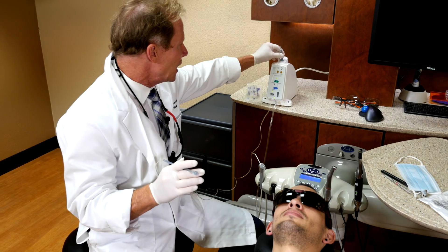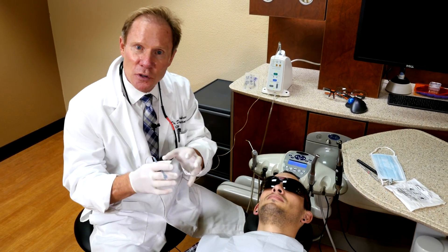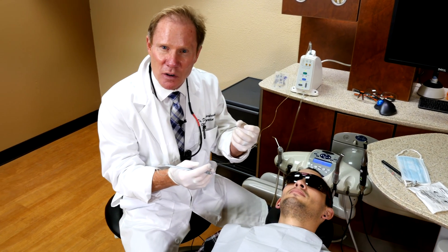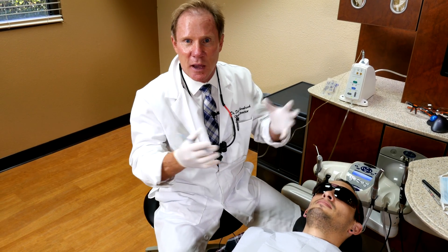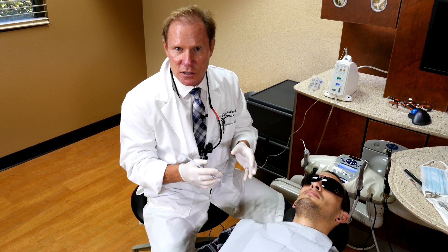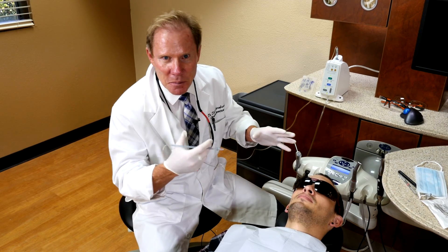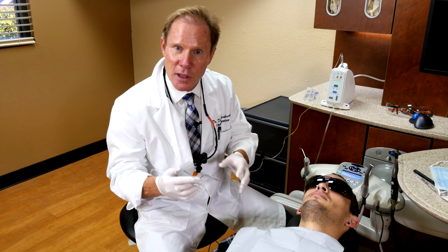We're going to go ahead and use Septocaine. The way this machine works, it is a computer-activated anesthetic delivery device, and it works on back pressure. We've all given palatal injections where you put the needle in, you squeeze, it seems like nothing's coming out, then all of a sudden a burst of anesthetic comes out and the patient screams because of the pain and tissue expansion. This device can give injections much slower than anyone can do manually, and it measures the back pressure and delivers the anesthetic to compensate for that back pressure.